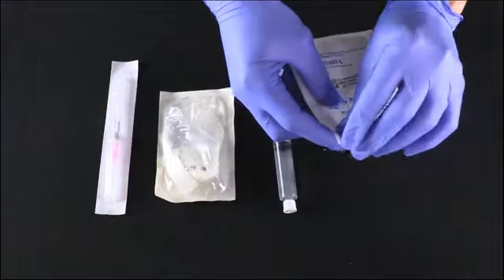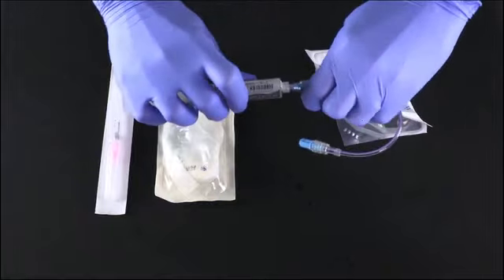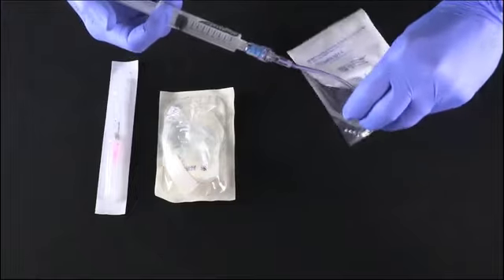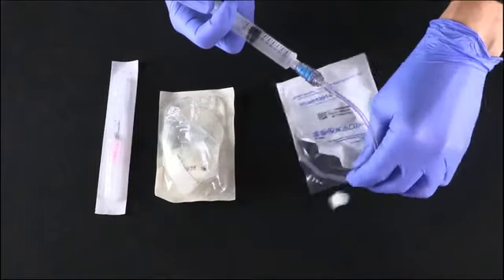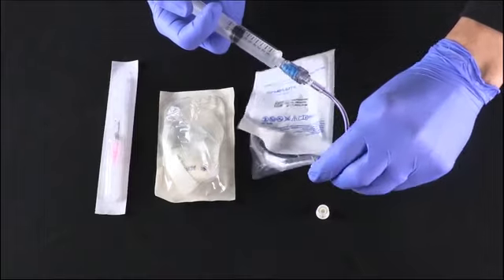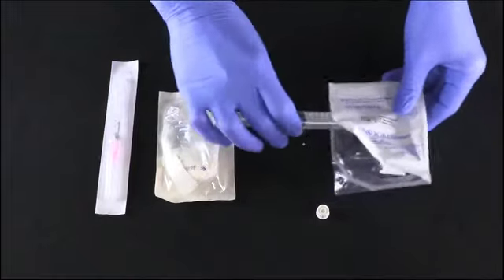The next thing you'll do is open up this extension set kit. This one comes with a cap by default. Always make sure that cap is there. And then you want to prime it. One other thing I like to think about is that this end right here is going to be the part that actually attaches to the IV, so you want to make sure that it stays as sterile as possible. Once it's primed, then you want to clamp off the extension set to make sure that no air gets trapped in there and make sure that it's all ready to go for your patient.